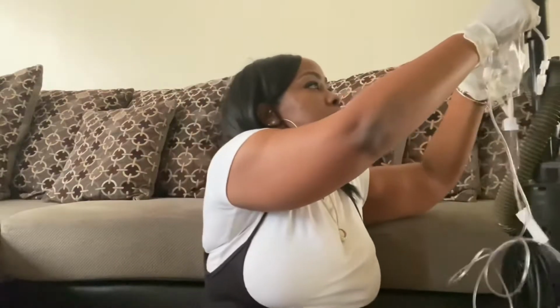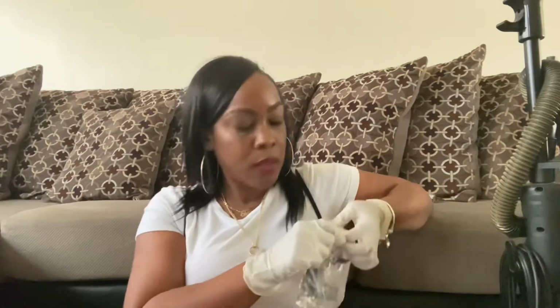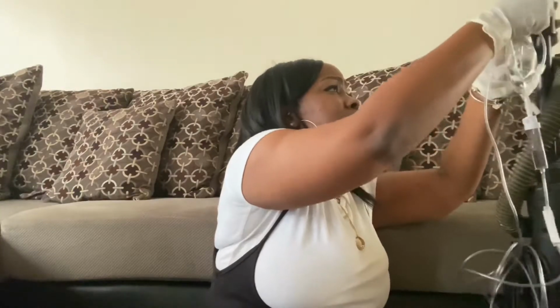So, oh, can I do it? I thought it was going to be easy for me to hang it on here. I don't have anything to hang it with. Yeah, I thought I was going to be able to hang it on here. Oh, woo, I did it.